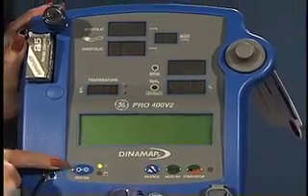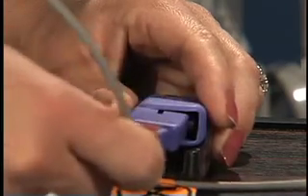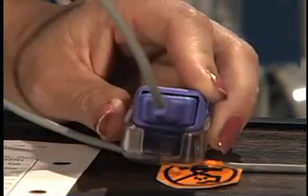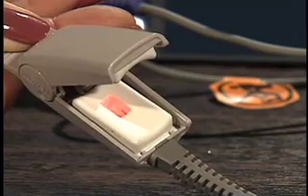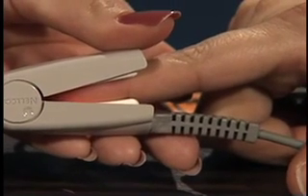Turn the monitor on. Connect the sensor probe to the pulse oximeter and listen for audible beeps from the monitor indicating that it's functioning. Apply the probe securely to the digit, being sure that the light sensor is over the nail bed with the other sensor lined up on the opposite side of the fingertip.